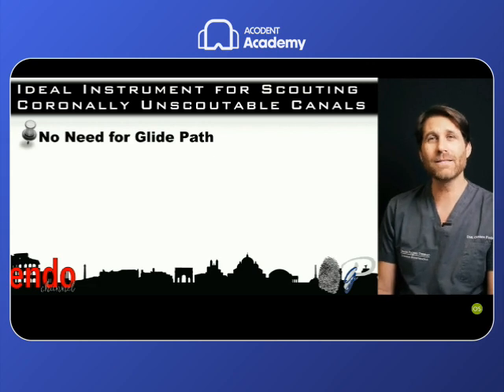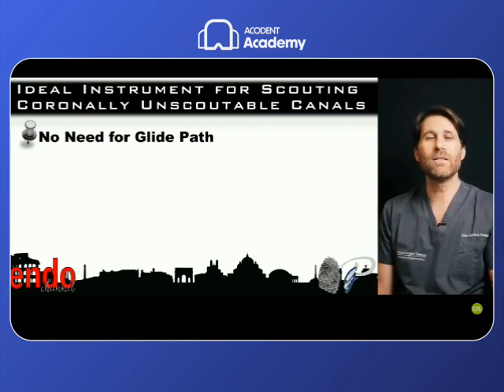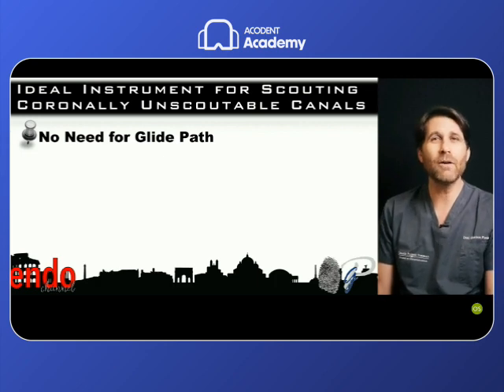These properties are that this instrument must not need a glide path, because in this case we don't have a glide path, since we tried, for example, with a manual scouting, and it was not possible to scout this root canal.